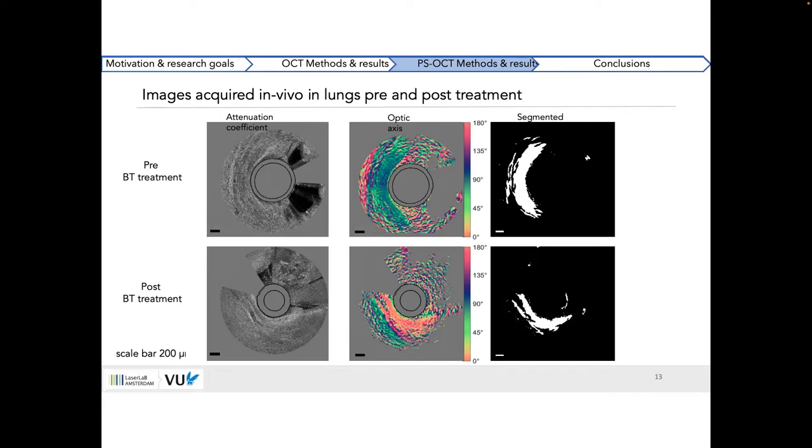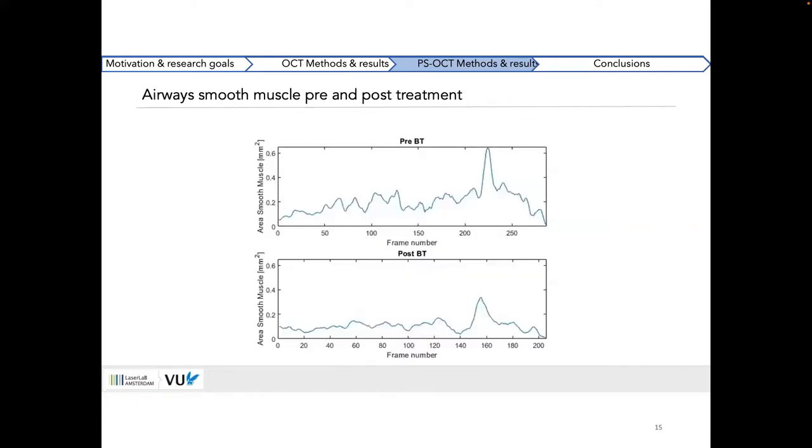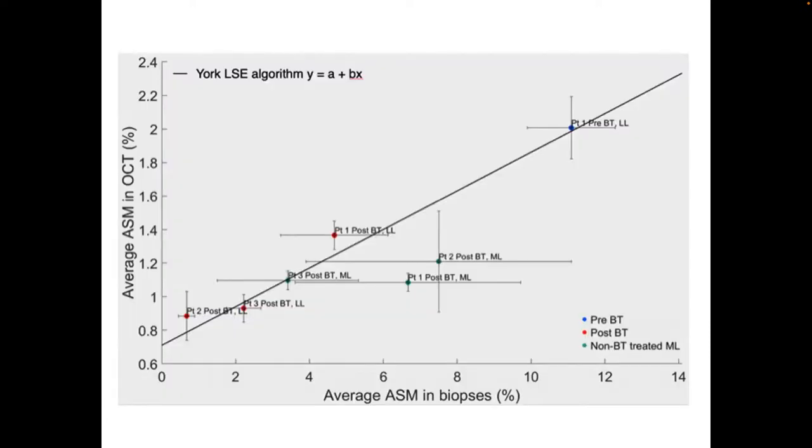From these images, you can't see that very well, but this is a graph now of these pullbacks, before treatment and after treatment. And from this graph, you can already see that there is a difference, and that post-treatment is thinner than before. So the treatment has had an effect. And then this is the final graph.